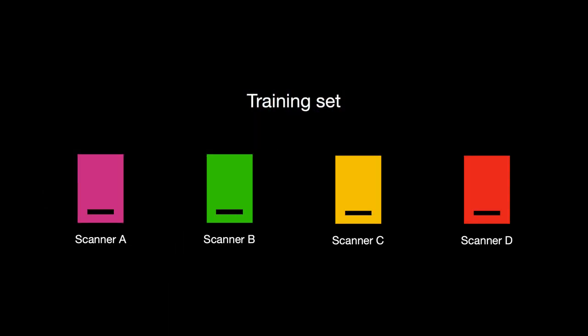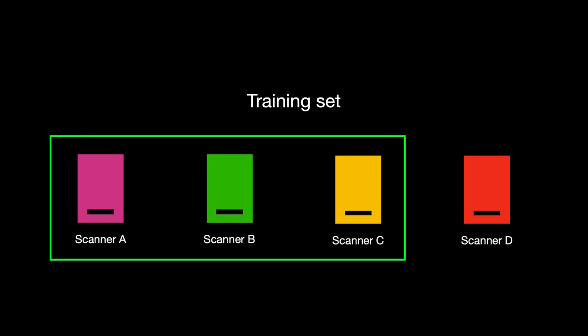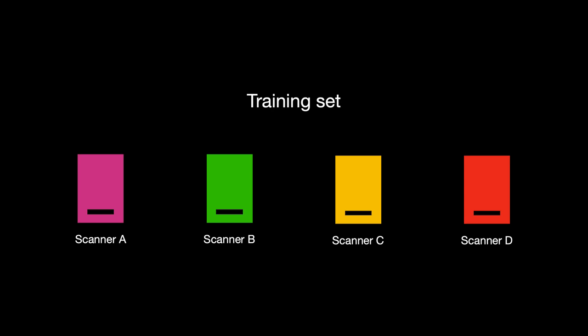So we got 4 scanners in the training set, each with 50 images representing 50 cases of breast cancer. All cases were taken from the diagnostic archive of the University Medical Center in Utrecht, the Netherlands. Out of those 4 scanners, only 3 have annotations for mitotic figures, while 1 dataset can be used for data-driven domain adaptation and generalization.